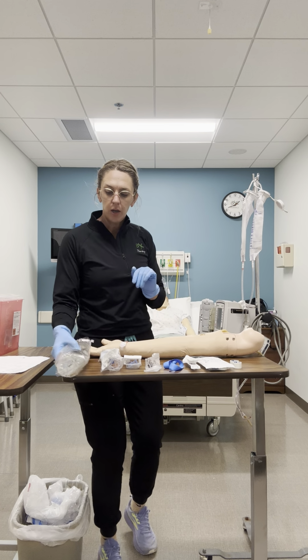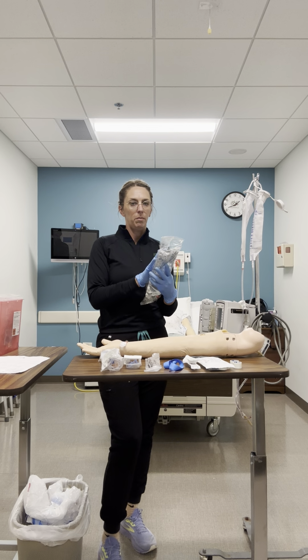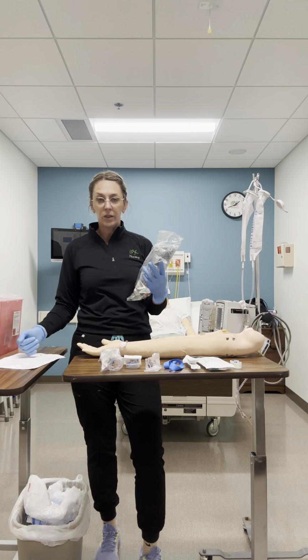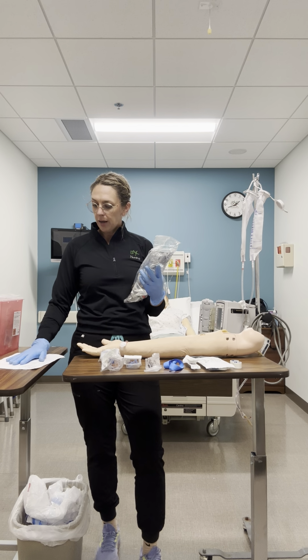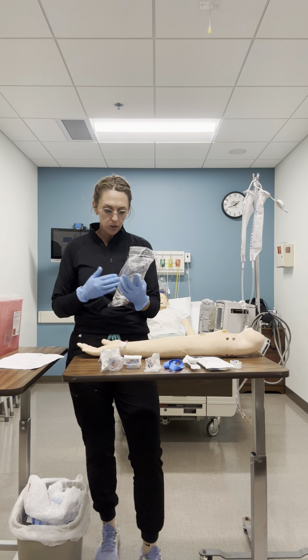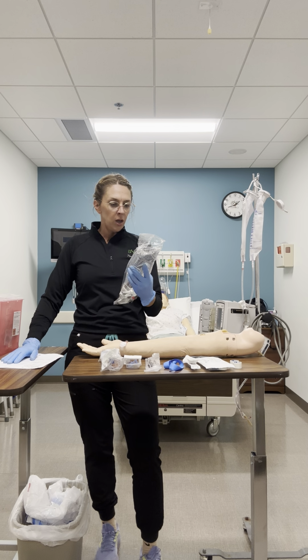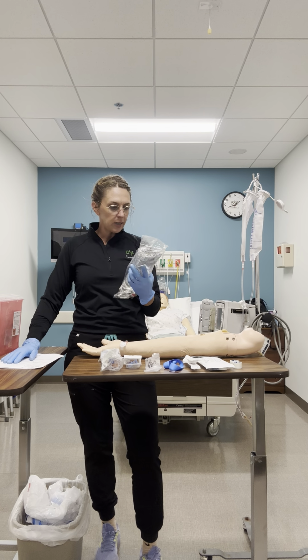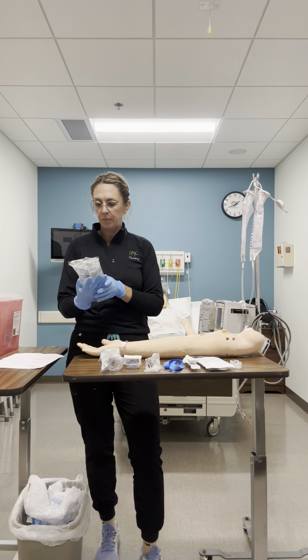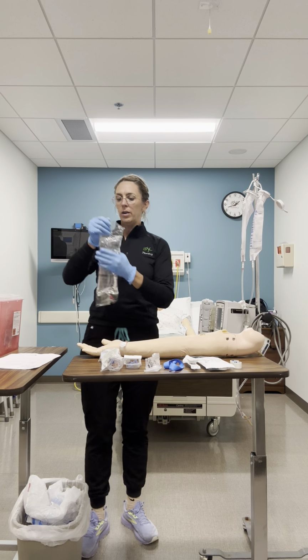So the first thing that I'm going to do is my first medication check on my saline that's been prescribed. I'm going to follow the 7 rights of medication administration, check that against my MAR. It is the correct medication. It's the right dose. We'll be setting that in the pump. It's the right date. It's the right route, the correct patient, and the right reason. So everything looks good there.